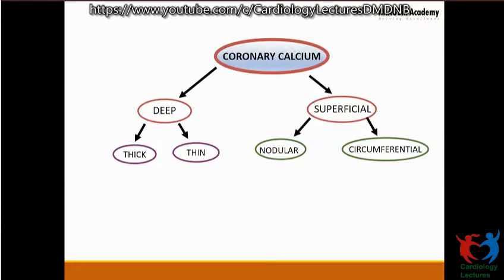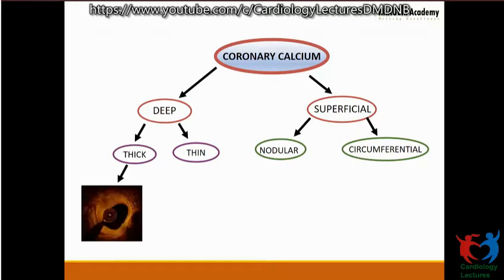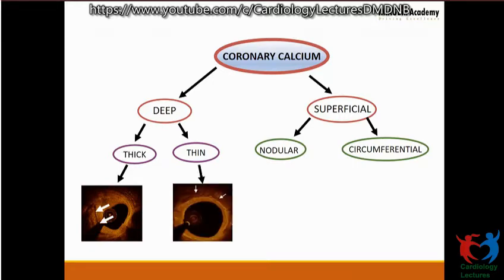Well, coronary calcium is very, very important. I have always stressed coronary calcium. The coronary calcium could be deep or superficial, and in either situation, it could be thick or thin. If you see thick calcium, it appears deep. Thick calcium is not a major problem. You can use a cutting balloon. You can use other balloons, and stent expansion is assured. And the same is the case with thin calcium. It does not basically change your stenting.